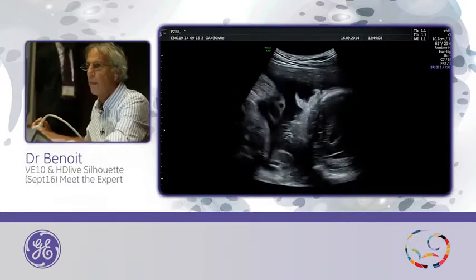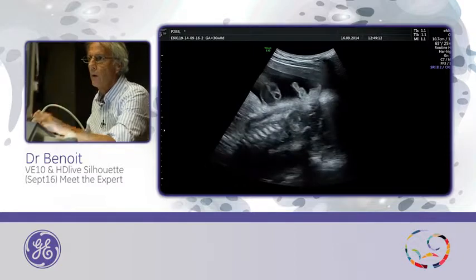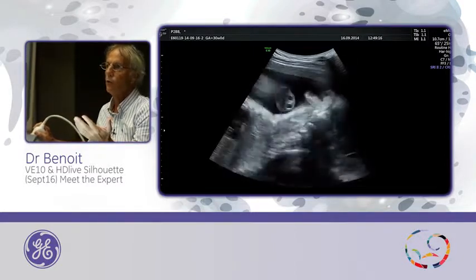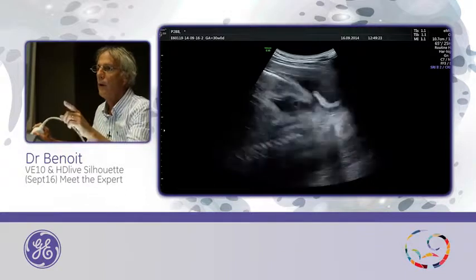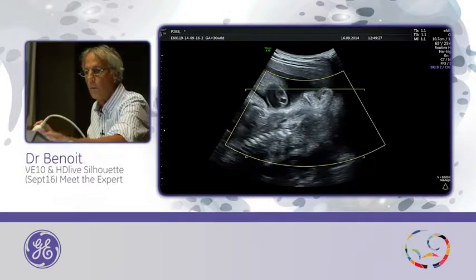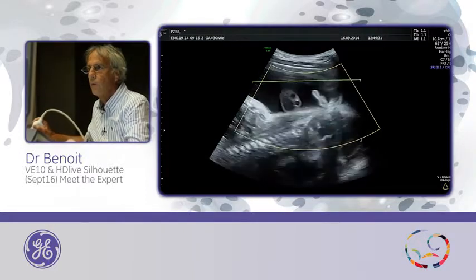And this is one ear. So I will start, when I do my 2D examination and also 3D, I am opportunistic. That means I do what I want to show the baby. So now you can see this is one ear.